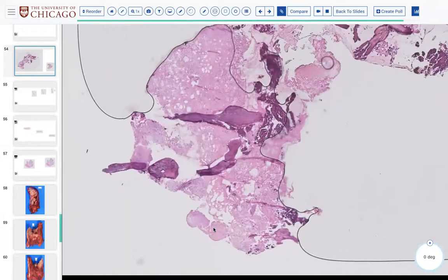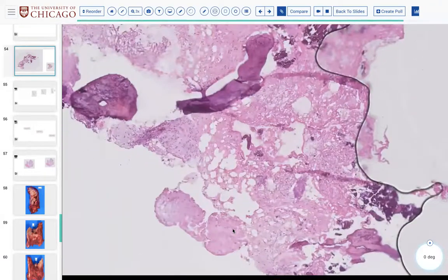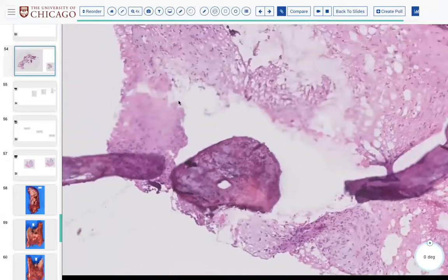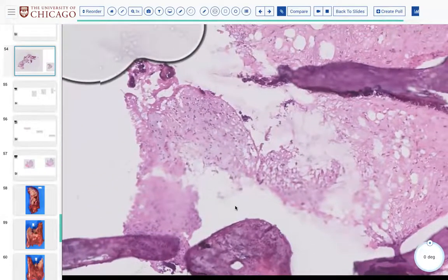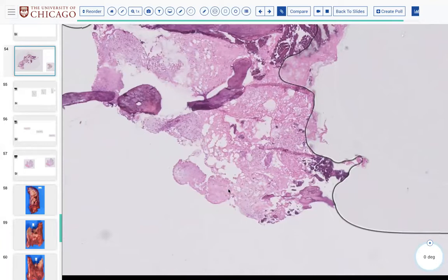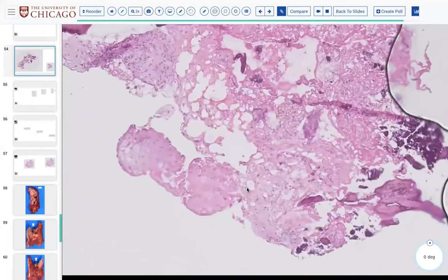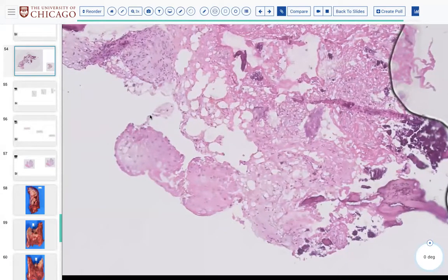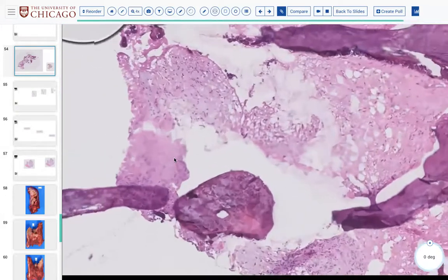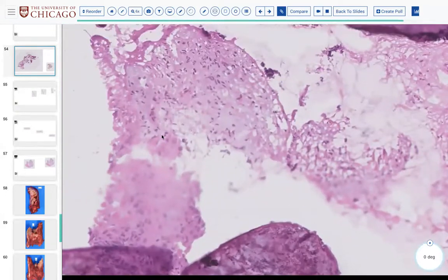But doesn't it look like the surface maturation, you know? I guess my question was similar, like, is this a contaminant? Yeah, contaminant is definitely a possibility if it's not attached. But it seems like the tissue is attached here. It seems like it's connected nicely, doesn't it? So I think at least here, despite the blurriness, these epithelial cells look to be in continuity, like they're hooked up with that stroma. Yeah.